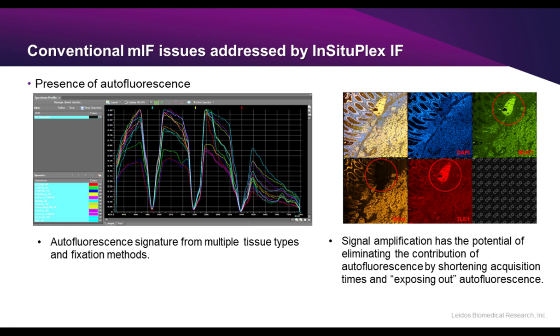Thank you, Katir. Now, does the number of markers used on a slide affect downstream data analysis? For example, is it better to do a few markers on many slides or highly multiplexed in one? So I can address this one right off. It really kind of depends on what your questions are and what your experimental design and your hypothesis is. If you just need to get density of, say, CD3 cells, it really doesn't make a whole lot of sense to throw in several markers, tens of markers, onto a slide. That just makes the process more cumbersome, labor-intensive, costly potentially, and you're really not getting an advantage.